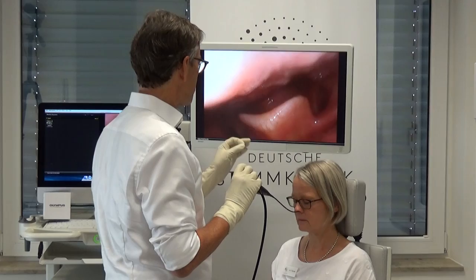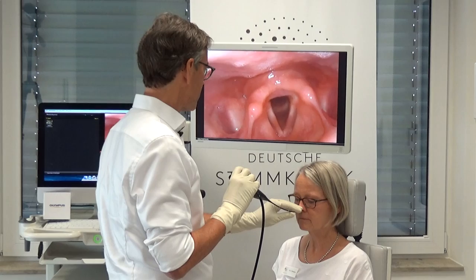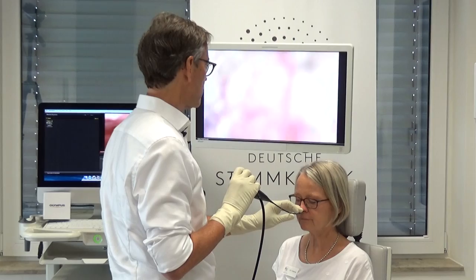So to summarize: first you have to train with the patient in front of you to estimate how long the inspiratory level is, so you ask the patient without dipping in, give me a long inspiration. If you estimate two or three seconds, then the dipping maneuver has to be done in two or three seconds or even less. If it's short, you go in, hold still for half a second, and go out. If she can prolong it for longer, then of course you can stay in longer. Thank you.